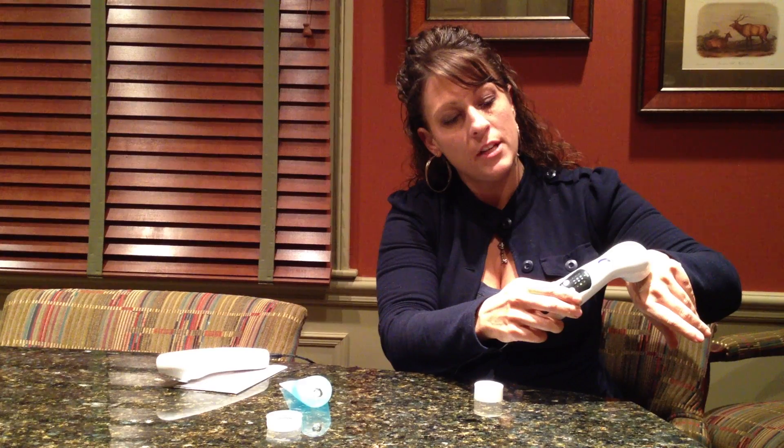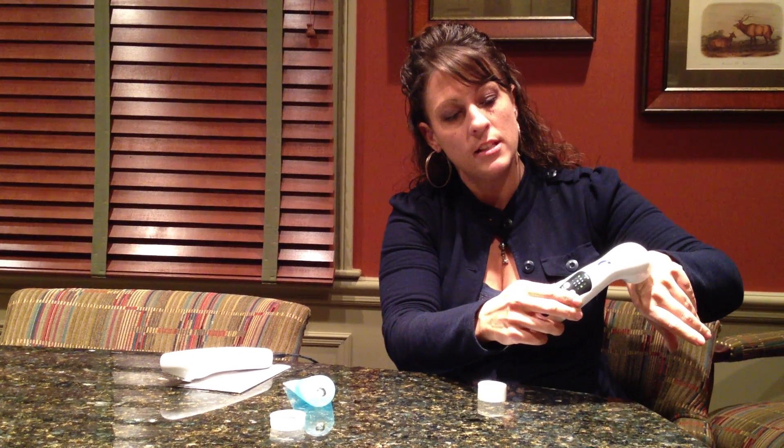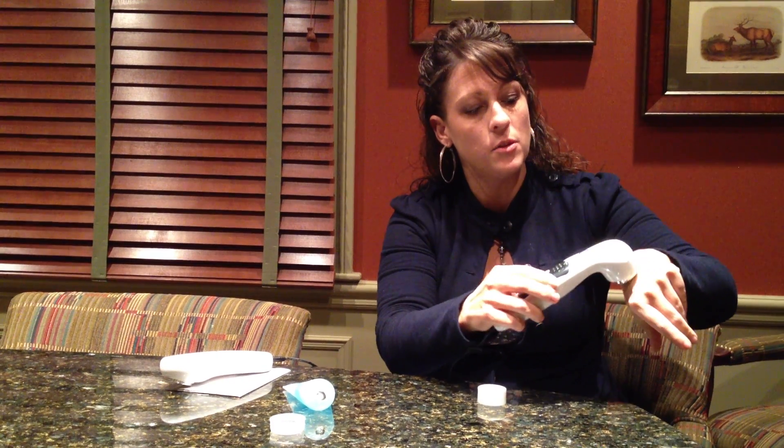As you can see, the light stopped blinking. If you have an issue where the light continues to blink, that means you are not having good contact with your skin and you need to apply more pressure or apply more ultrasound gel.